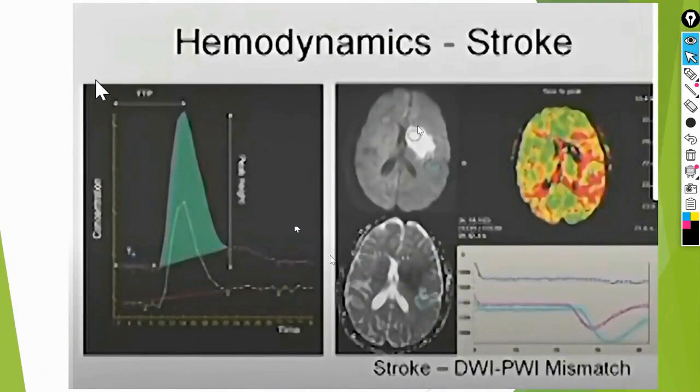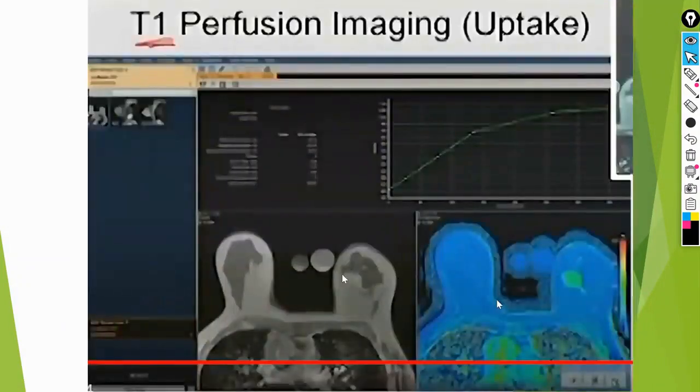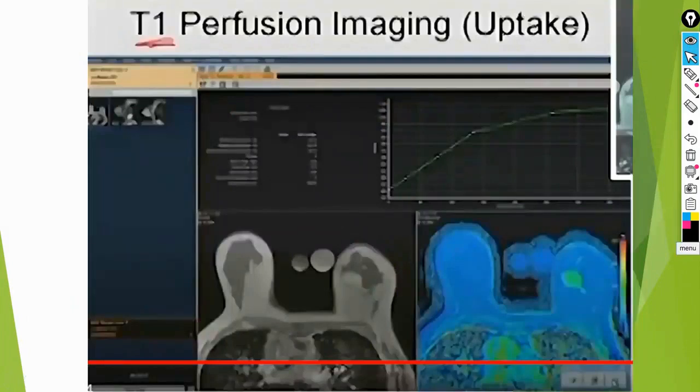Sometimes they also study cases like this. Look here. For example, there was a change in the signal in these places. I want to show you, in the breast, for instance, if we assume that I am not talking about T2, but rather about T1, how would it look? If we flip the situation to bright, yes, it would be bright.